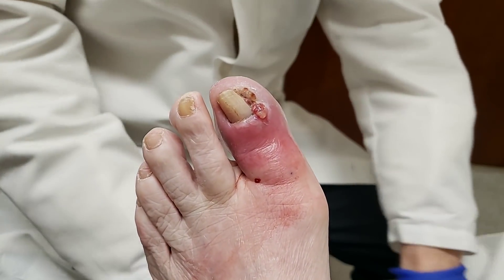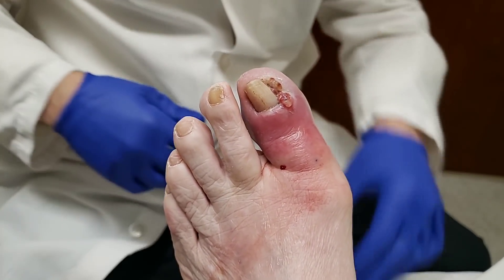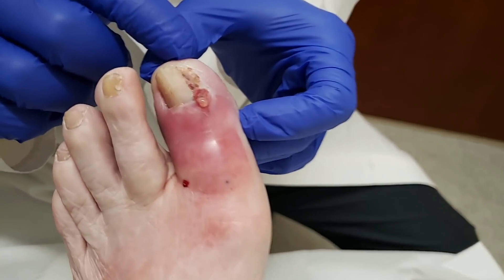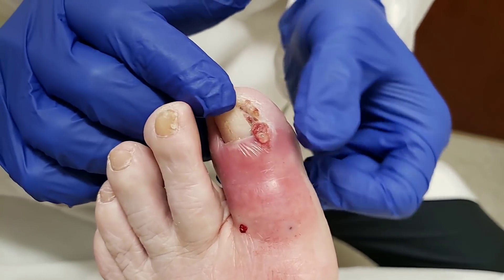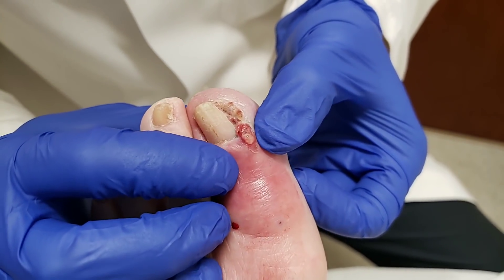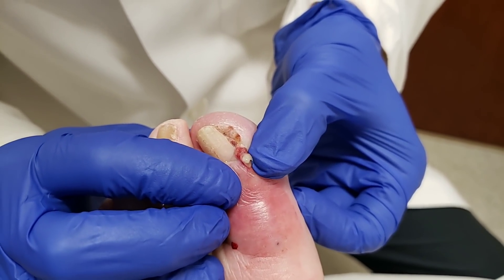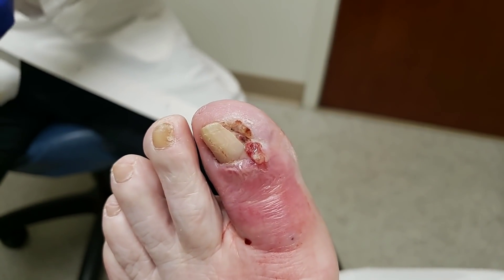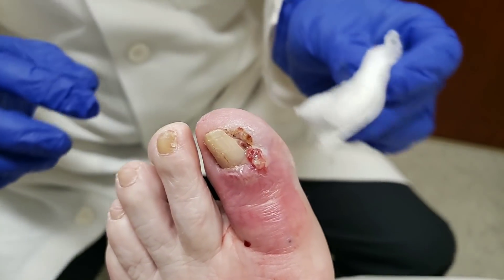Hi, this is Dr. Donald Pelto here. We're looking at a patient that she actually came in a couple of days ago for an ingrown toenail. And there's a couple of concerns because there is a little pus. If you squeeze this, that white stuff there, that's some pus that's in there. That's not typical with an ingrown toenail, so there are a few concerns that we had.